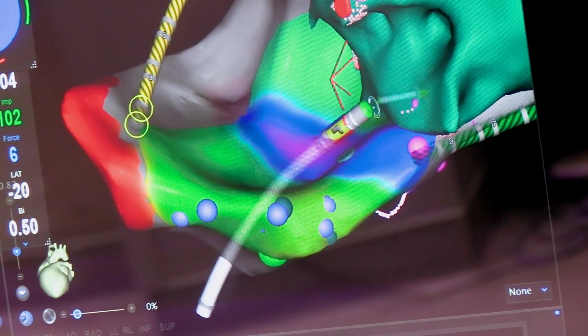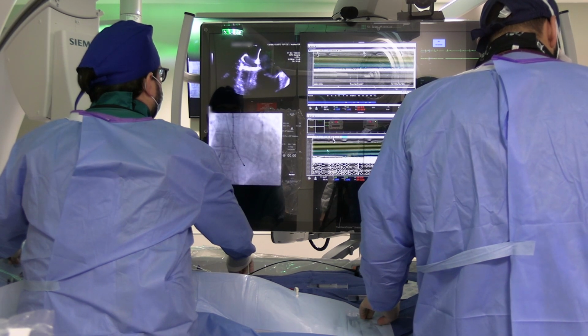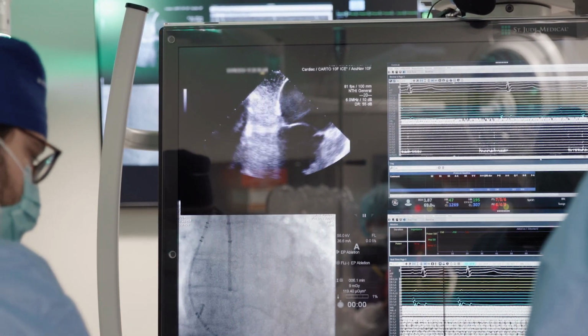Tailoring the workflow to the different modes in which it can be applied really depends on the situation. For example, if you're trying to ablate on the posterior wall and you know for sure that anatomically that's where the esophagus is, and if you're using intracardiac echo, you can actually see how close you are to the esophagus. You know that that tissue is thin. You don't want to go beyond that, and so the shorter you apply the lesions, the shallower the lesion will be, and the less likelihood of injury. So this is the way of prescribing how you adjust this, and a lot of people do this.